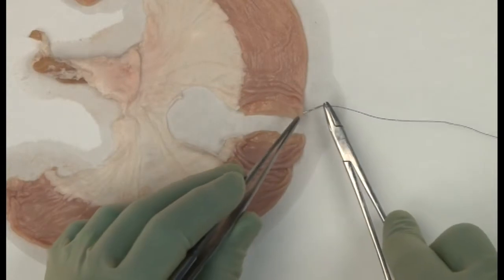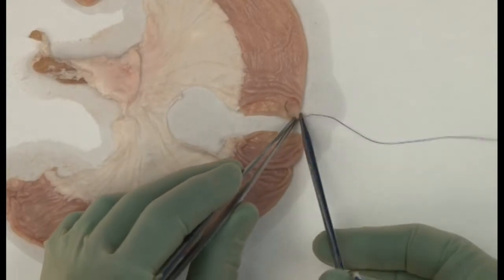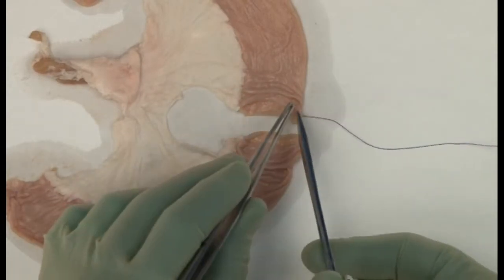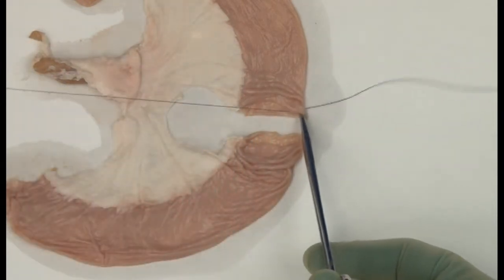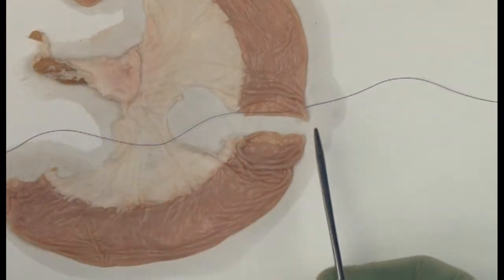We now have the task of an end-to-end anastomosis of the two remaining bowel ends. For this anastomosis we will use an interrupted full thickness suture.